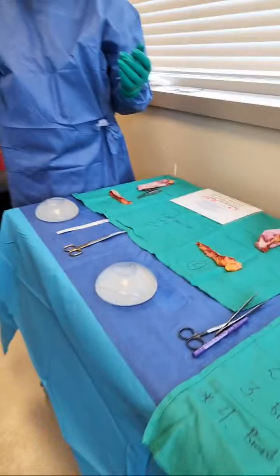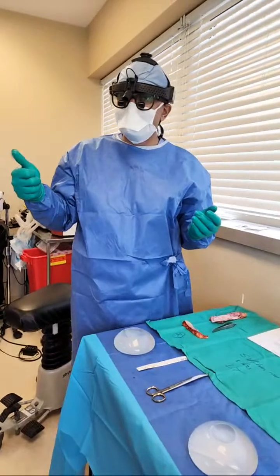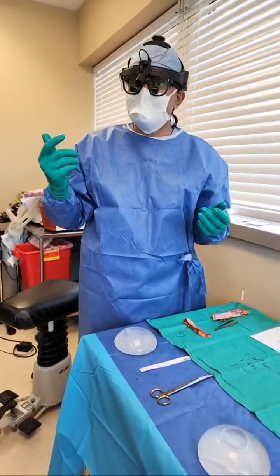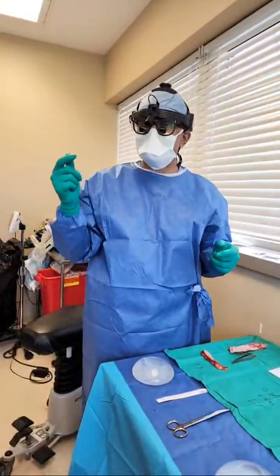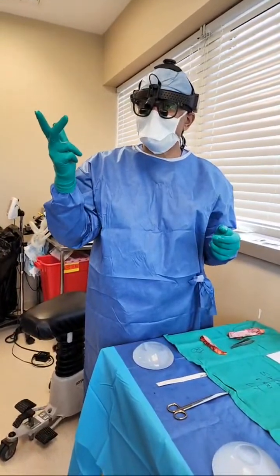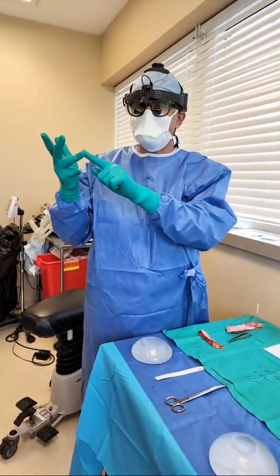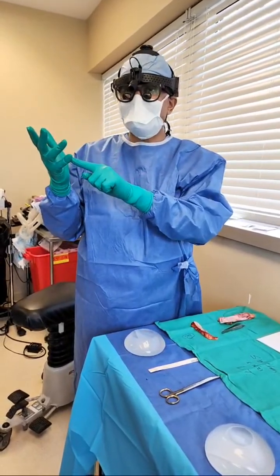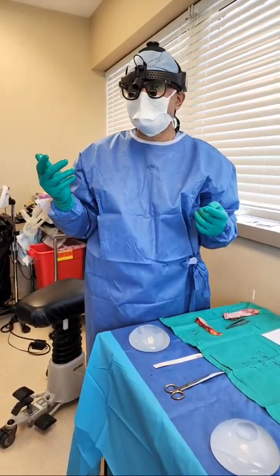very thin capsule. So this is the en bloc procedure. This is how I do it. Number 1, the implants are always returned to the patient, be it saline or silicone, so that the patient has mental closure that this is what was removed. Number 2, capsules are always sent to pathology to rule out BIA-ALCL, with CD30 analysis. Number 3, cultures for aerobic, anaerobic, and fungal are sent to the microbiology lab to rule out bacterial and fungal infections. No need for a lift, especially in a young patient like this 24-year-old. No need for drains. The blood loss was clearly minimal, maybe 3 cc's each side.